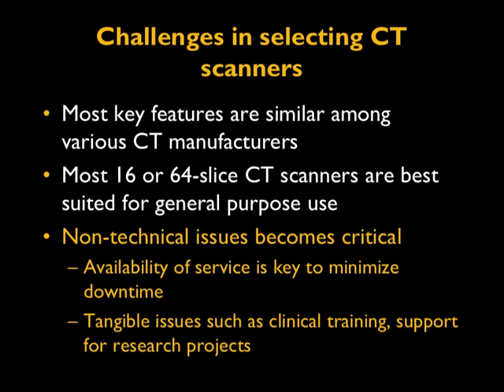The second non-technical issue that becomes very critical is tangible issues. Tangible issues such as clinical training and support for research projects, especially for special application scanners, become very important in selecting the CT scanner.